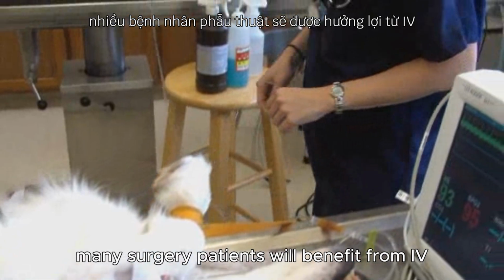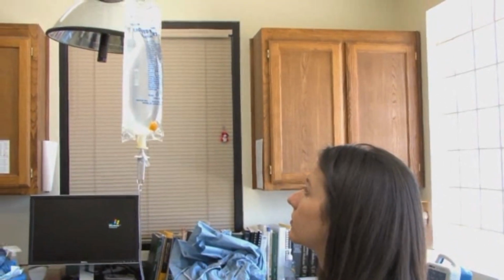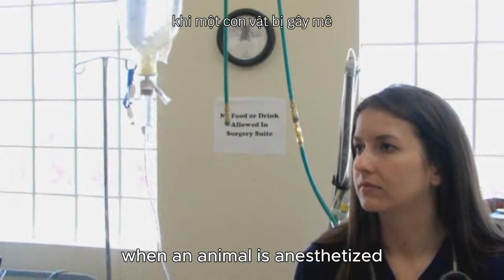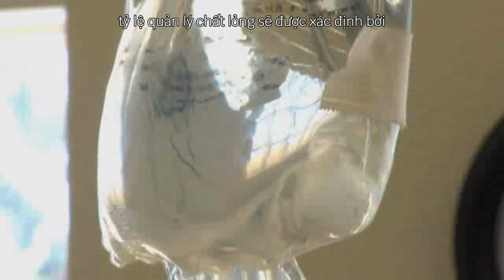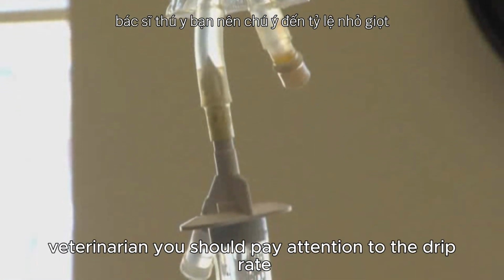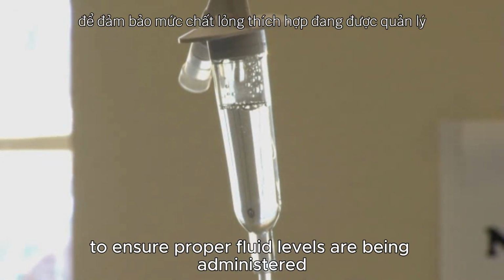Many surgery patients will benefit from IV fluid therapy during the surgical procedure. Fluids help support the blood pressure when an animal is anesthetized and serve to help replace fluid loss associated with bleeding. The fluid administration rate will be determined by the veterinarian. You should pay attention to the drip rate to assure proper fluid levels are being administered.